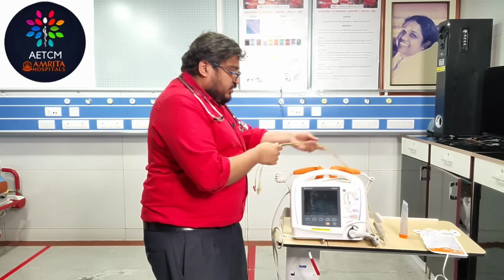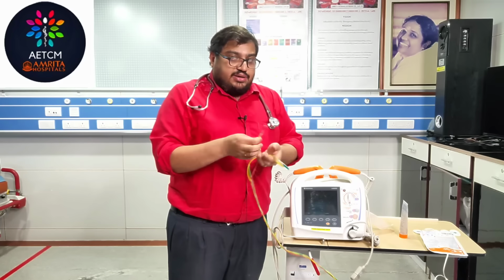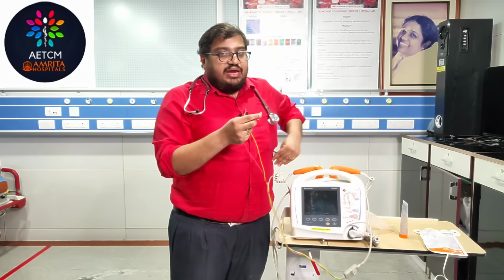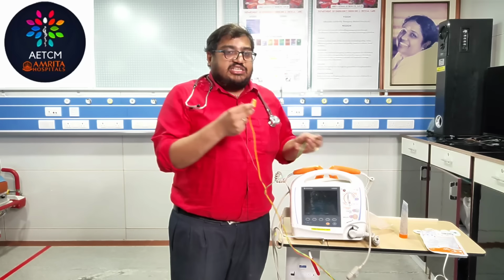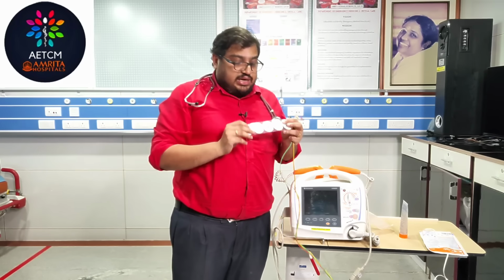Next thing is that you will be having cables like this, 3 cables. So red to the right shoulder, yellow to the left shoulder, and green to your apex. So this is the placement of your leads, and you should be having your electrodes like this. These are the electrodes that are available.